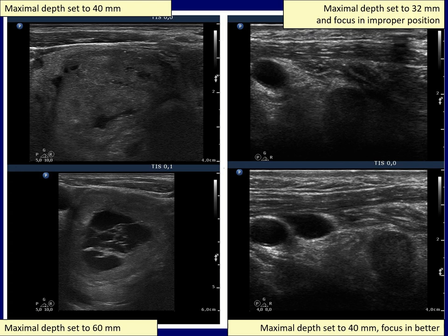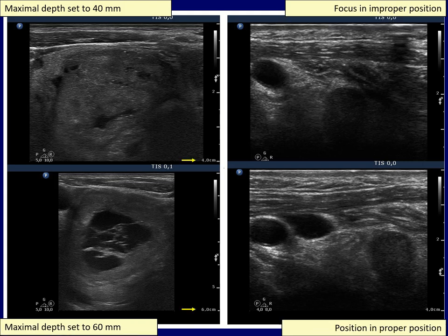Let's see some examples. First, the left nodule. In the upper image, the depth is not adequate because we cannot see the dorsal part of the lobe. By increasing the depth, the dorsal parts became visible in both cases.